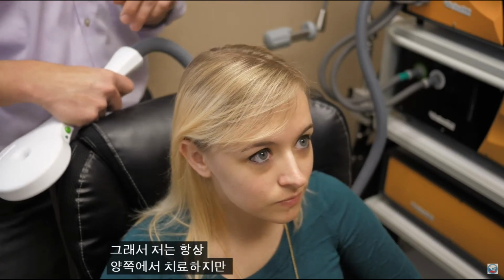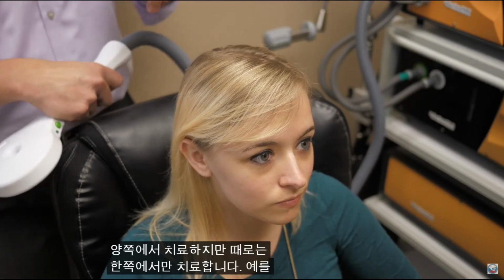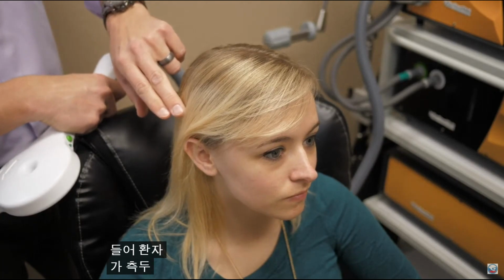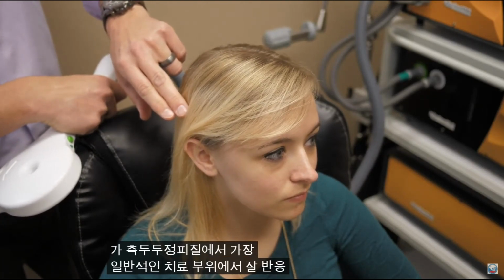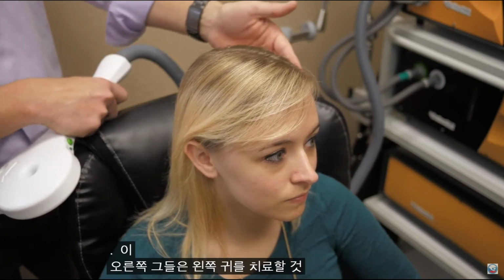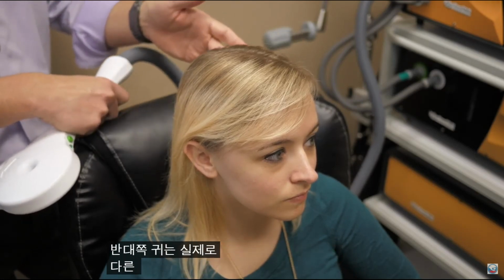Both sides. However, sometimes the treatment on one side, so let's say, for example, the patient responded well here at the temporal parietal cortex, the most common treatment site. They may not, that would be treatment, for example, on this right side, they would treat the left ear. The opposite ear may actually respond in a different location.